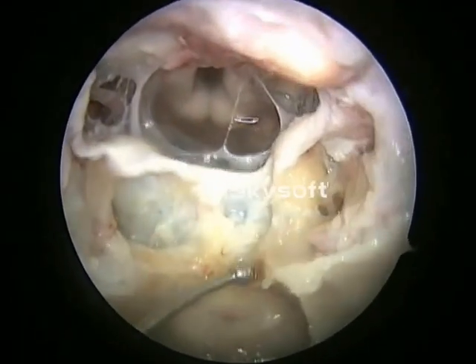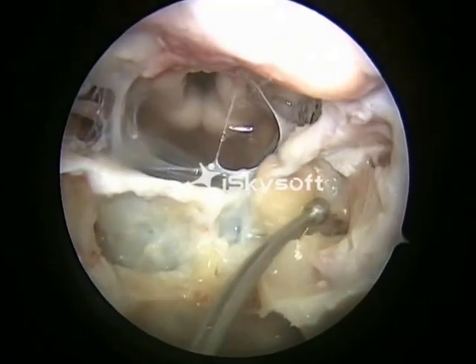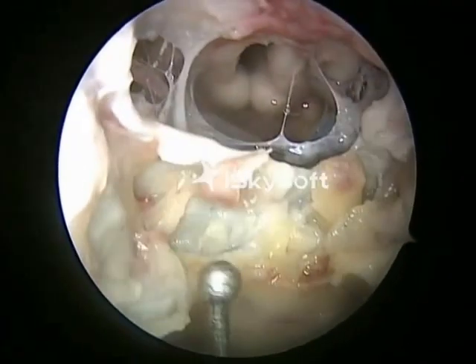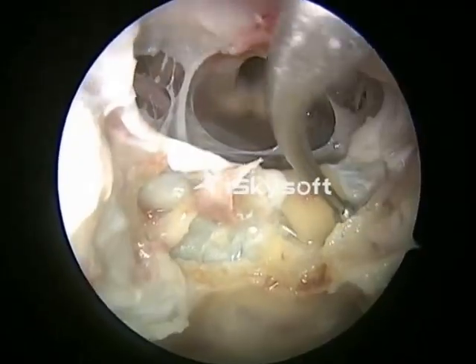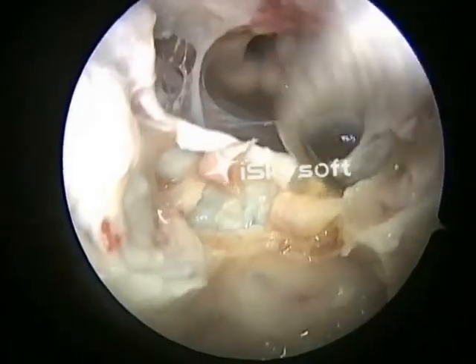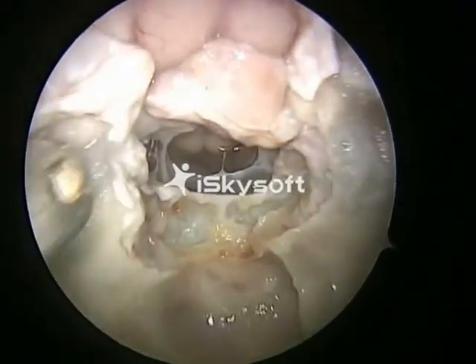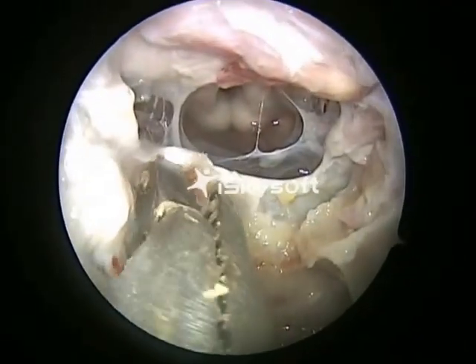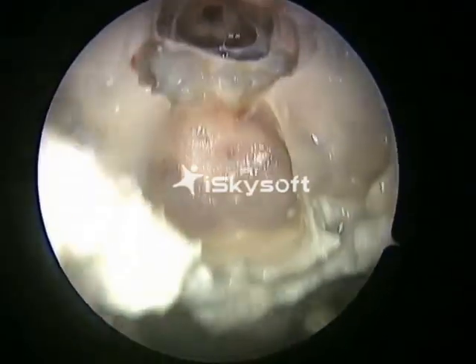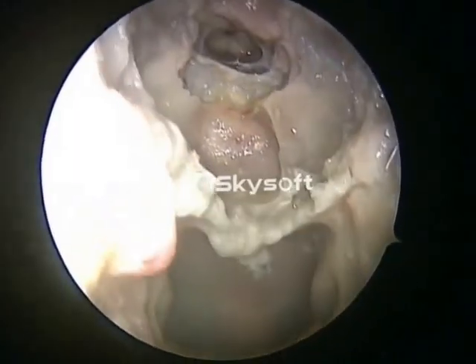Now we are here removing the posterior clinoid with a ball probe. That's the posterior clinoid process. This is on the right side. That's the posterior clinoid process being removed. And once that is done, we will be proceeding on to dissecting the middle and lower portion of the clivus.